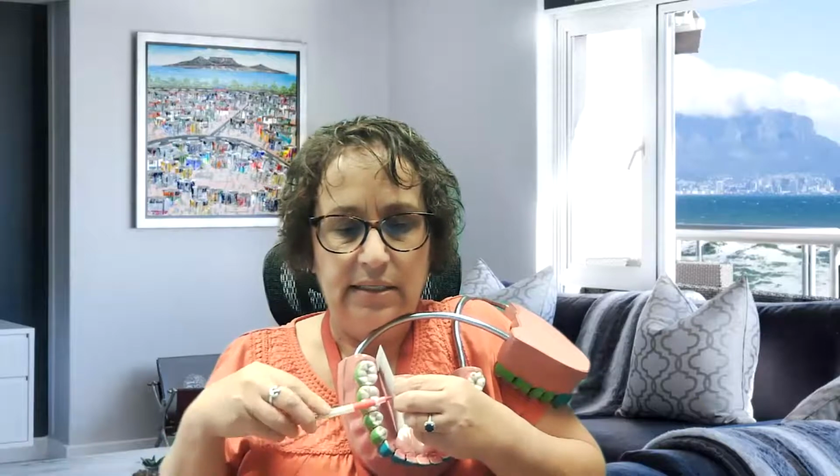So even if my film turns like this, I still need to be perpendicular to my film in order to get what I need. But if I turn my film too much, like so, I put it like this, and it's not parallel to my teeth anymore.